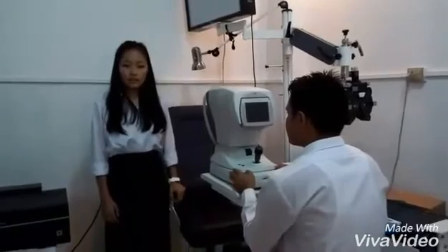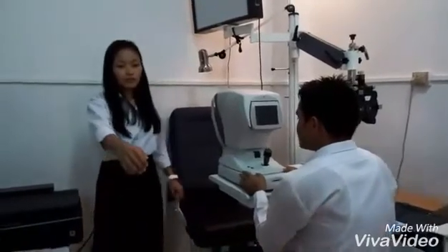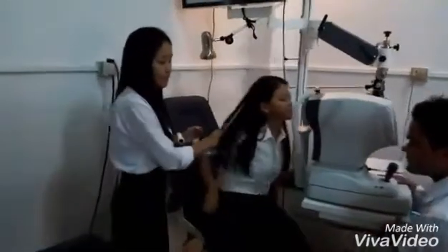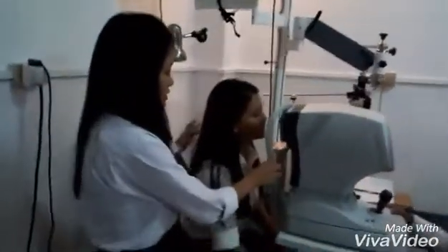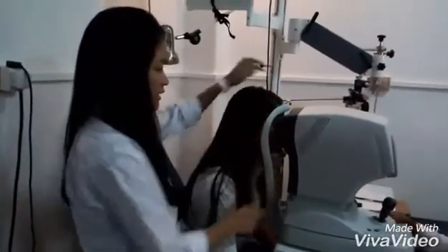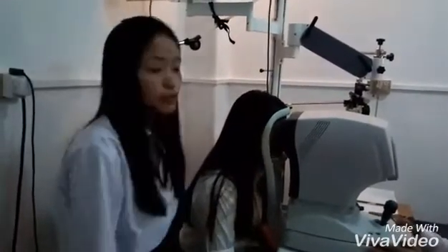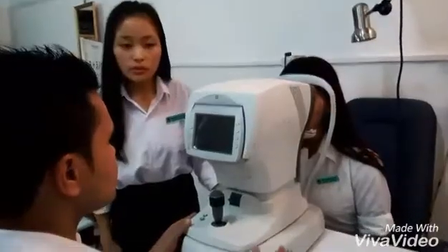Once the patient is instructed, the patient is seated comfortably with his or her chin on the chin rest and the forehead against the forehead rest. The marking should be aligned with the lateral canthus of the patient. Now the examiner will switch on the machine.